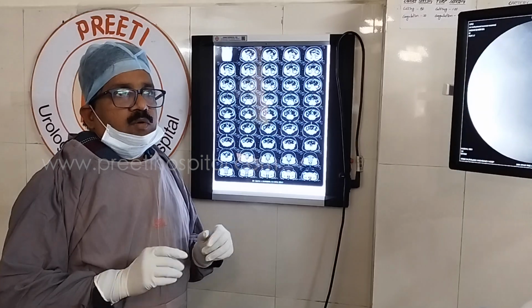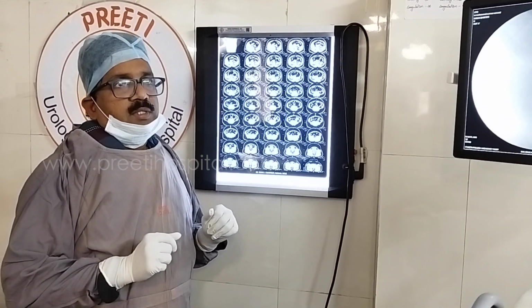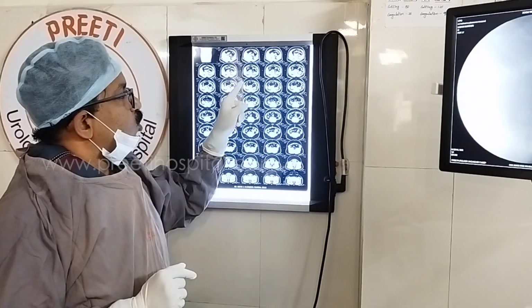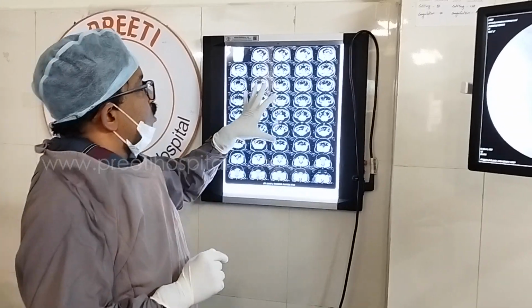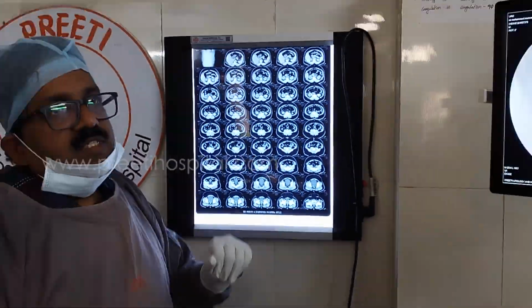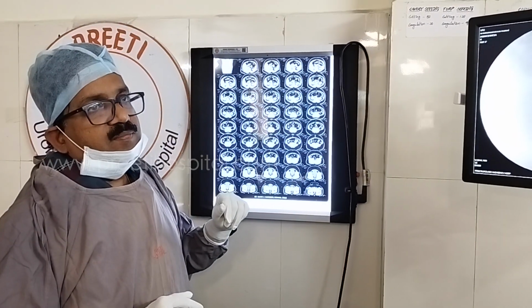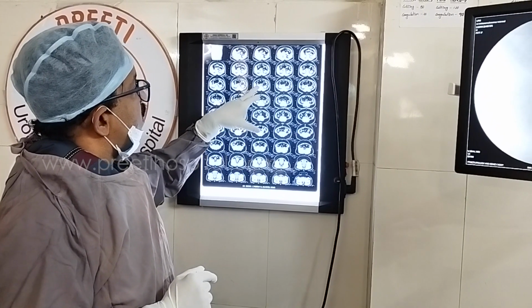Today we are dealing with the supine PCNL. A case of an obese patient, and there are two stones on both sides. Right side pain is there, so we are operating on the right side. When you see here, what is the most important thing you see in this column? Where is the colon you identify? This is the liver.